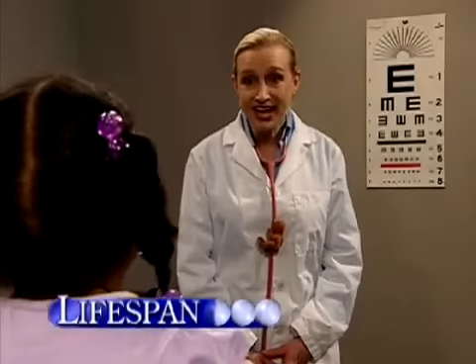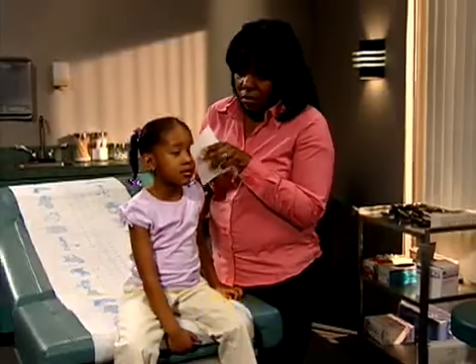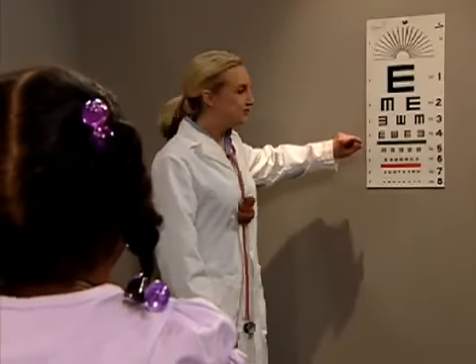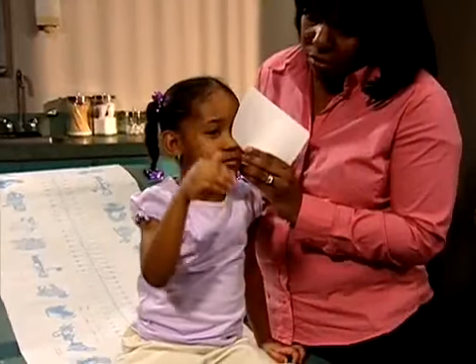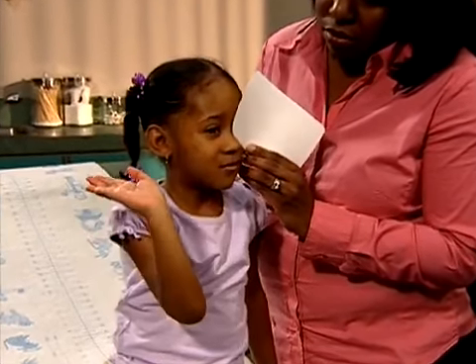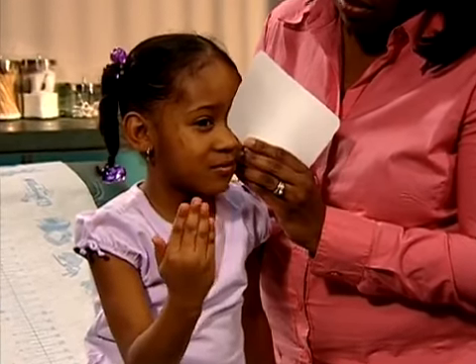Are you ready to play the E-game? Yeah. Good. Okay, Mom, if you could cover up one of her eyes. For a child or an adult who doesn't read English, use a Snellen E-chart to test visual acuity. Good. While you stand at the chart, have the child point her arms or fingers in the direction of the legs of the E. You may need an assistant, such as the child's parent, to help her cover one eye.